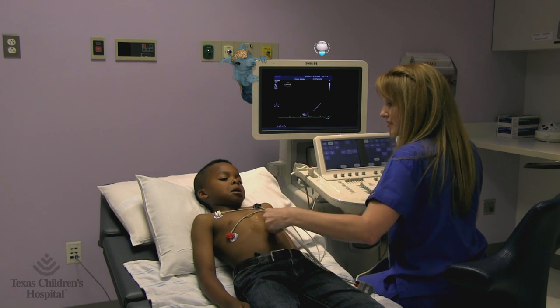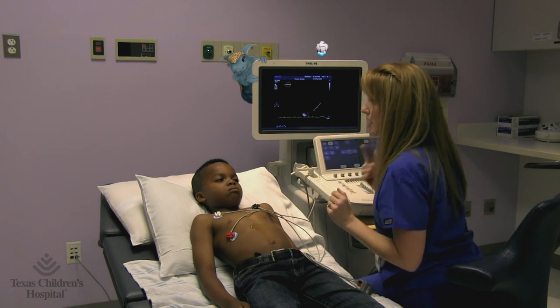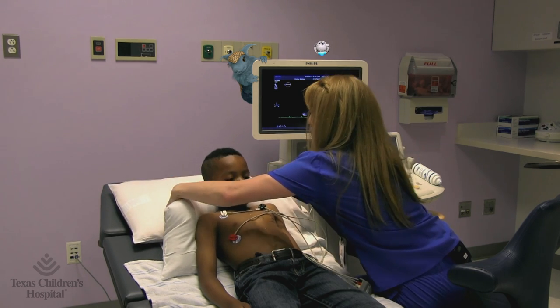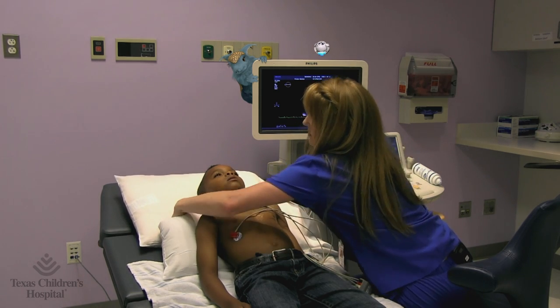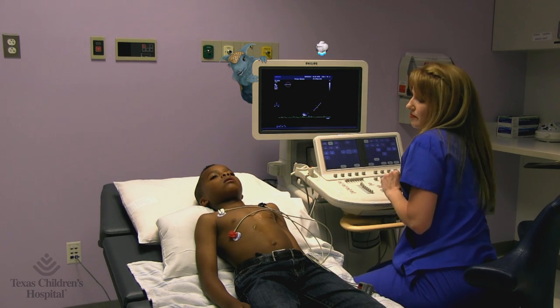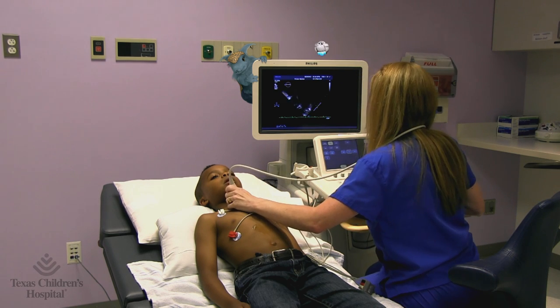You're almost finished. Just one last bit. Now we're going to change your position, and I'm going to take some from underneath your chin. I'm just going to feel your pillow go back, and just let your head go back. That's a funny way to lie down, isn't it? But just relax. We're almost done. This is so we can look at the big artery that comes off of your heart.